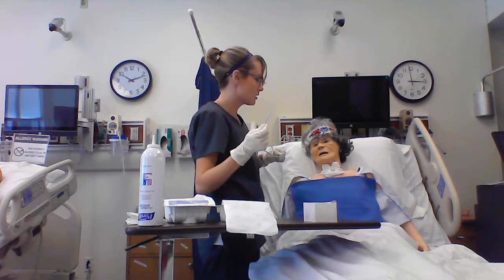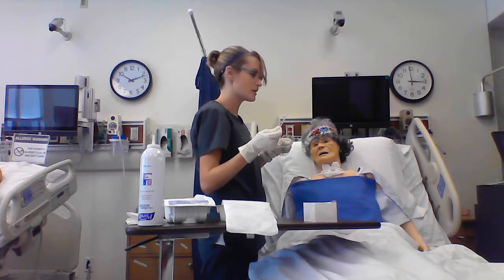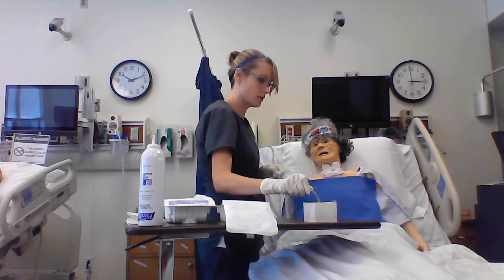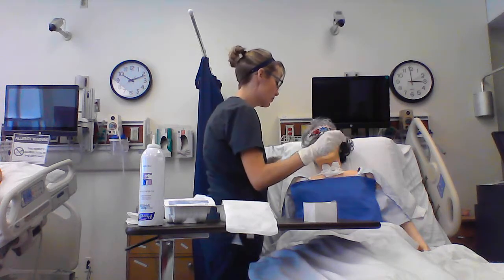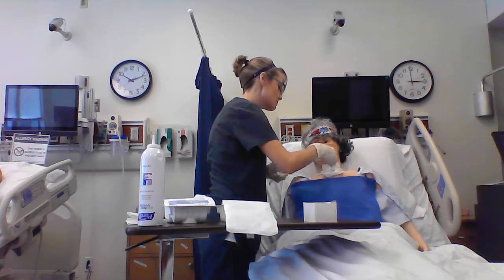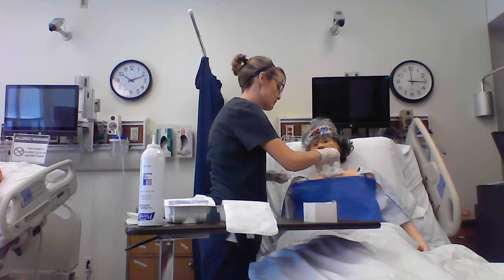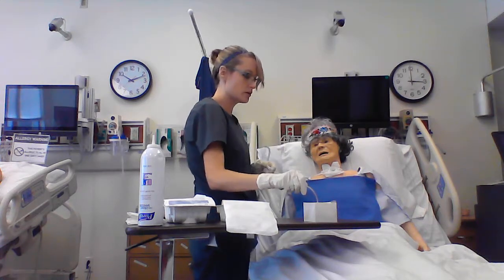And then give her a break. She needs a break and needs to be reoxygenated. You can take your contaminated hand, pull that oxygen back down until her stats improve. And then go back again to suction her, clear out your tubing. All right, we're going to go again. So you want to go down without suction until you meet resistance. And back up with intermittent suctioning and catheter rotation. And then you can clear your tubing out again.